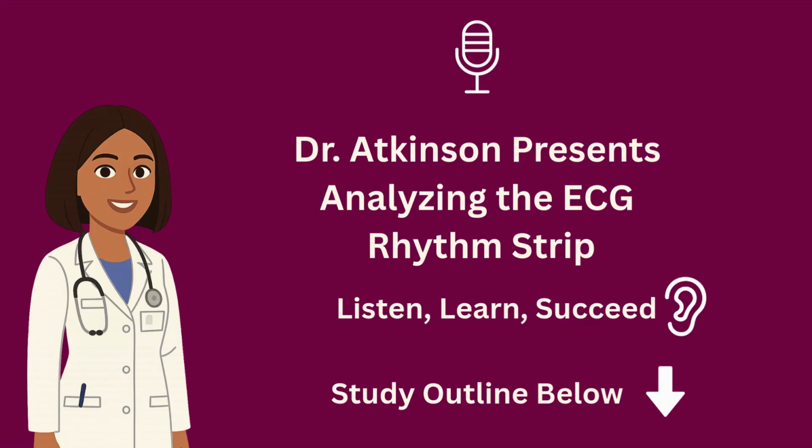And here's a quality and safety nursing alert. It's essential that we don't just silence alarms, but actually assess why they're happening. Adjust the alarm settings based on the individual patient, confirm the limits are appropriate, and discuss with the provider whether continuous monitoring is still necessary. Alarm parameters should be tailored, not one size fits all. Doing so helps reduce alarm fatigue and keeps patients safe.